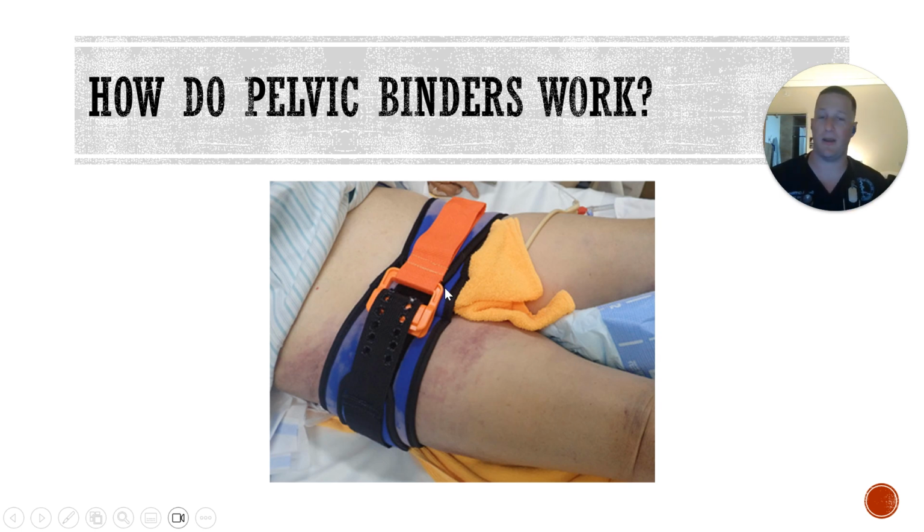I can show you guys cool tricks about how to use 2 tourniquets and a SAM splint to make a pelvic binder, and that works just as good as the commercially available ones. I believe this is a SAM splint, or the SAM company, the people that make the SAM splint, made this binder too.